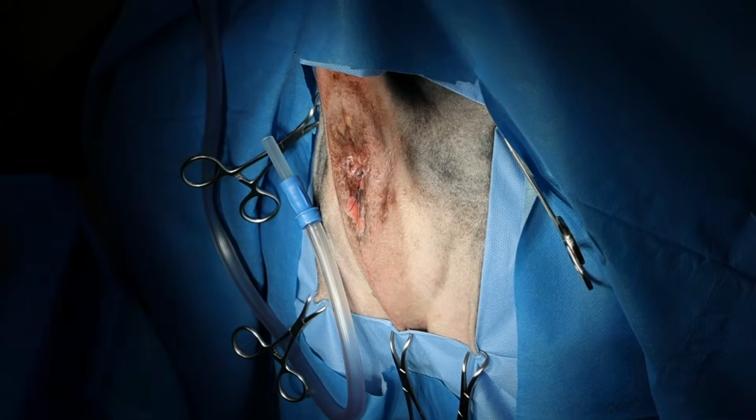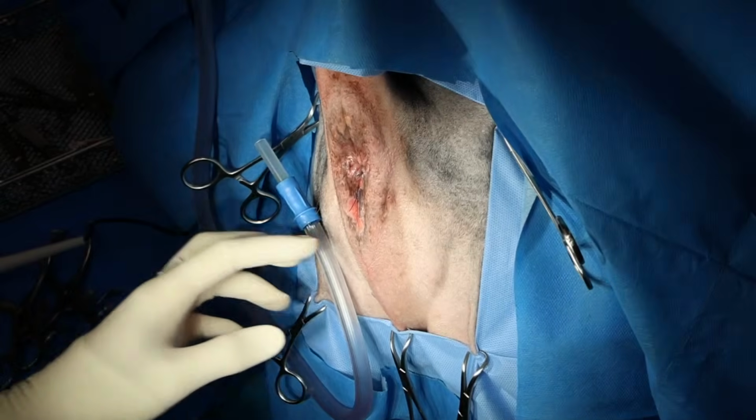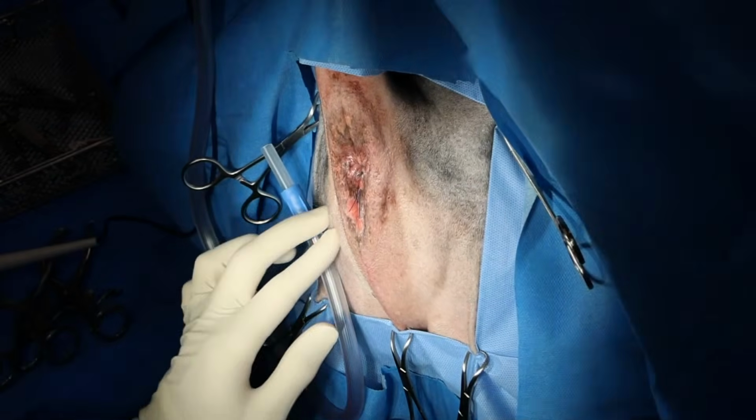Shepherd, 10-year-old dog, presented with straining for about 6 weeks duration. On rectal exam, they found a large bilateral perineal hernia, so you can see the hernial sacs on either side here. We're going to do an internal obturator flap repair.